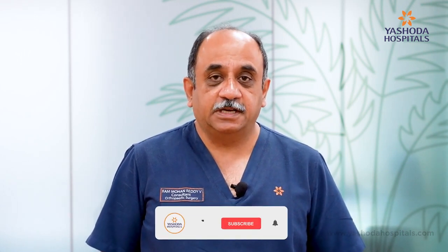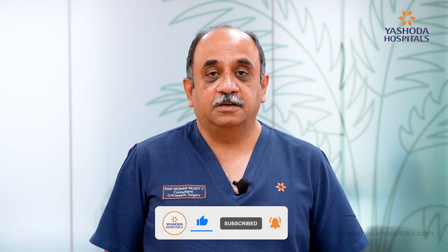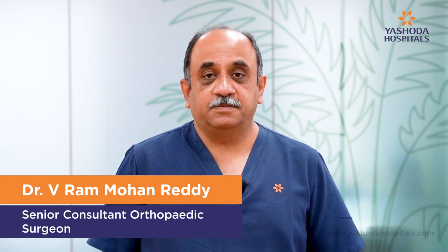The second robotic system is where there is a need for CT scans. This robotic system is more laborious. The CT scans have to be taken pre-operatively, and then it has to be put into the system so that the robotics equipment gives the landmarks and the necessary cuts that have to be made. Here as well the surgeon controls the robotic system. Again, the CT scan based robotic system can use the implants manufactured only by that company which uses that particular robotics.